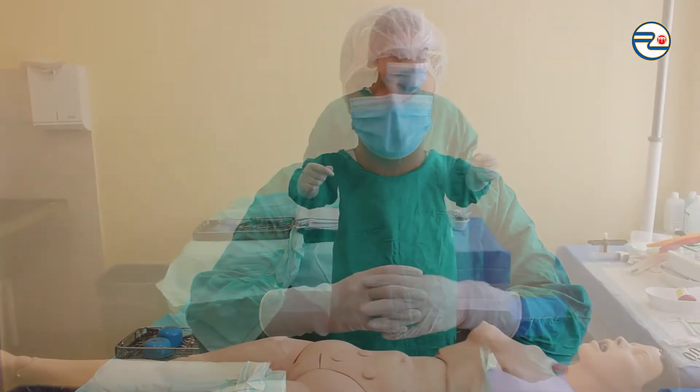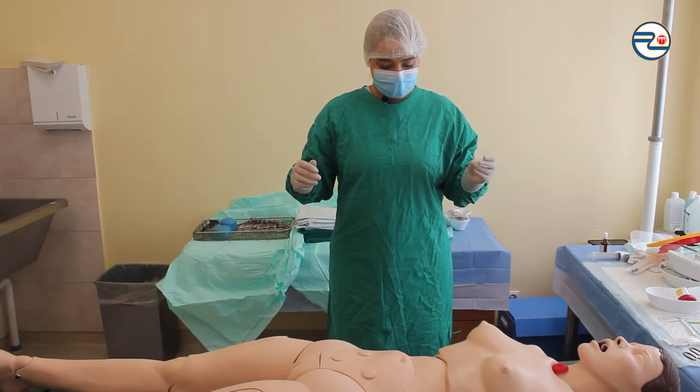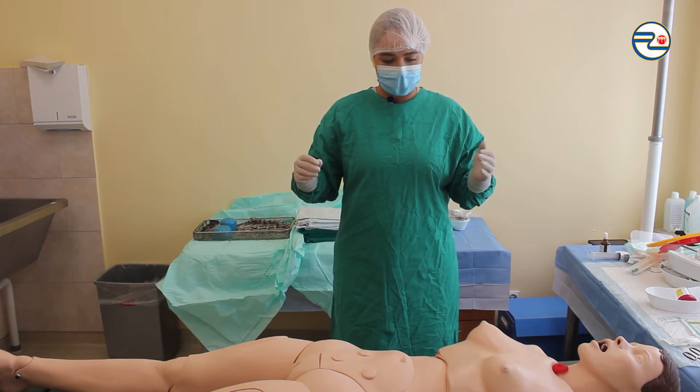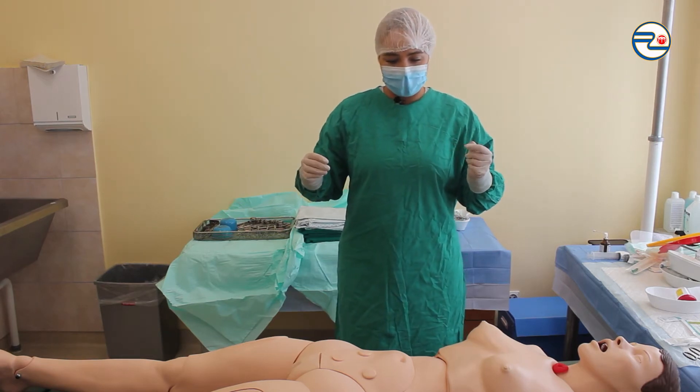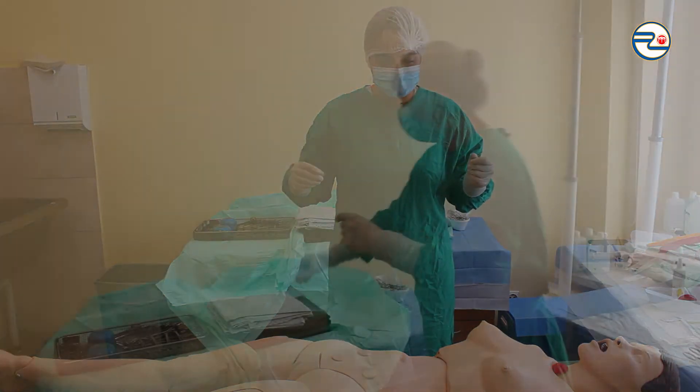I'm making sure that there is no non-sterile equipment around the surgical field that can damage sterile conditions. Also, I'm standing a little further away from the operating table to avoid compromising sterile conditions.